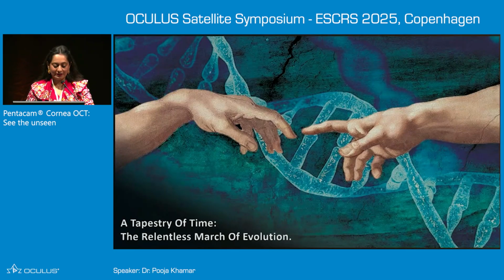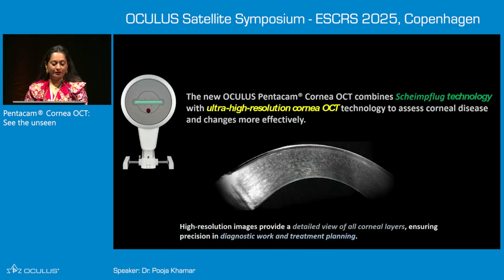So we all know that as we evolve with time, the diagnostics when it comes to cornea are also evolving. We started from Placido-based topographers, and then we became Scheimpflug-based topographers. Biomechanics came, which may help us in planning refractive surgery better. And now it's about the OCTs, the epithelial maps, and many more. So we are in a relentless march of evolution of how our diagnostics should evolve with time.